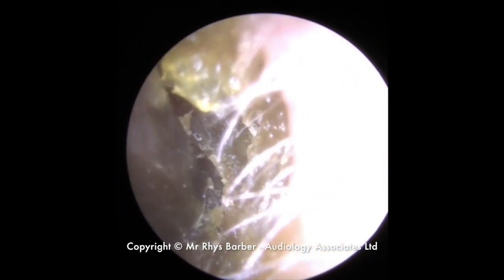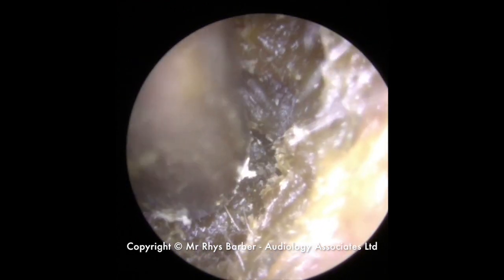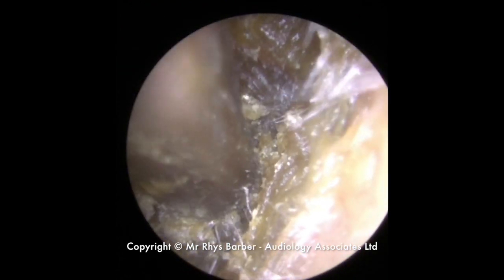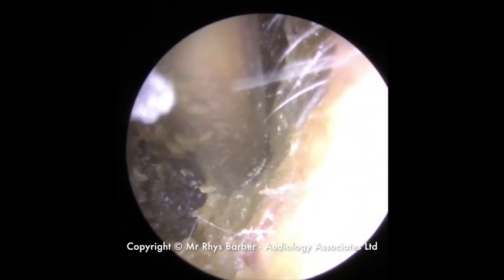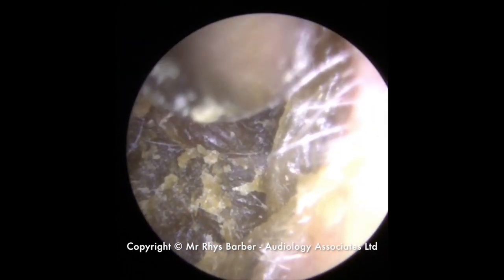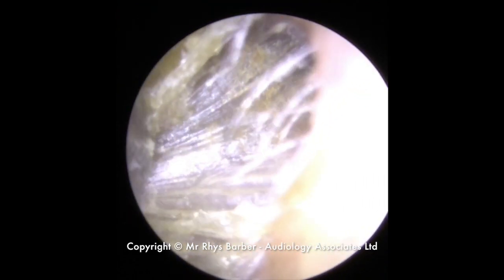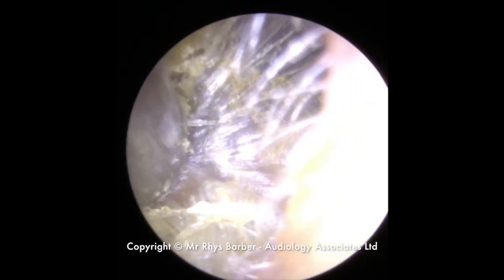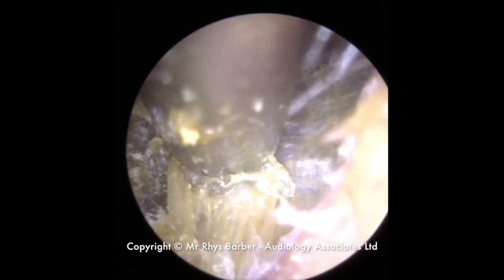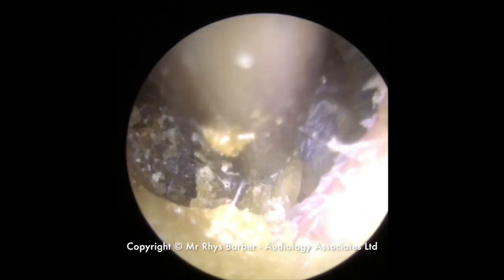You can just see a little ring on the right hand side of the screen there which is skin, which looks quite old and quite hardened. Sometimes when the skin is detached from the ear canal but it doesn't come away, you get this very hard, thick skin that builds up, which is really tough. And that's what's holding this lump of wax. You can see just how tough this skin is — I'm pulling on it just to try and remove it. See it really pulling on the canal wall there. Dead skin is detached but it's just really tough stuff.